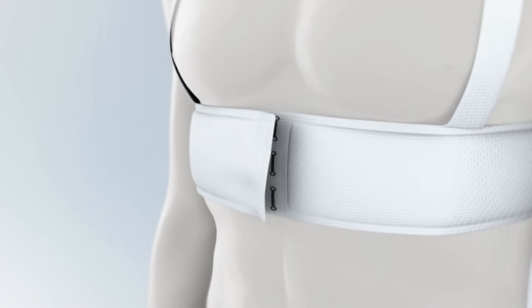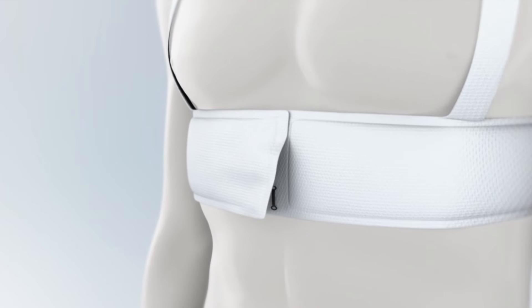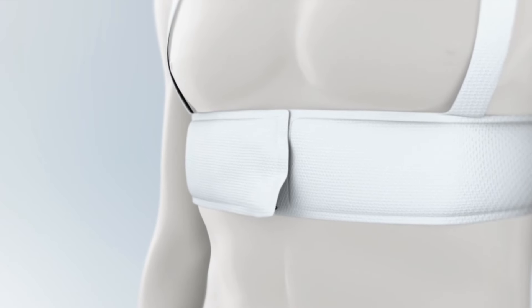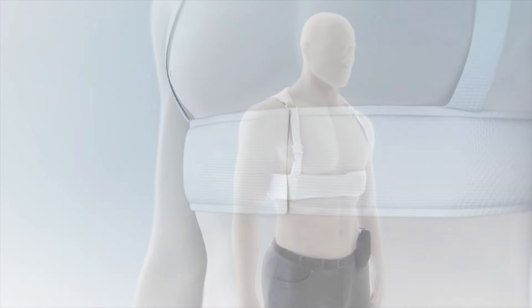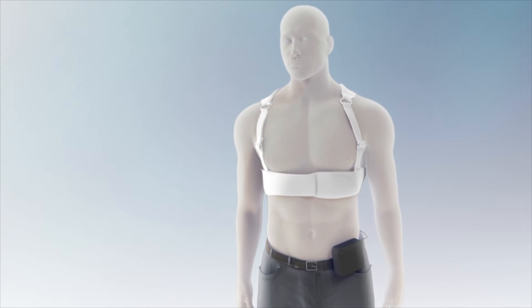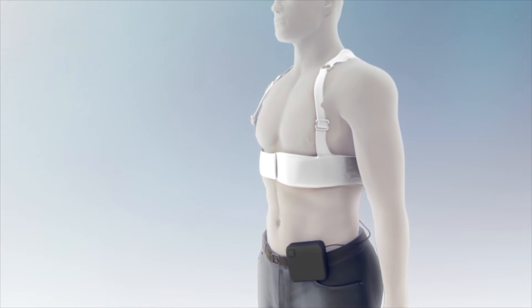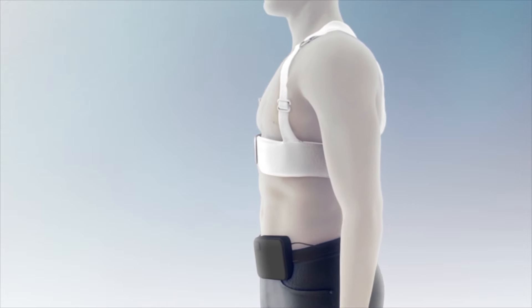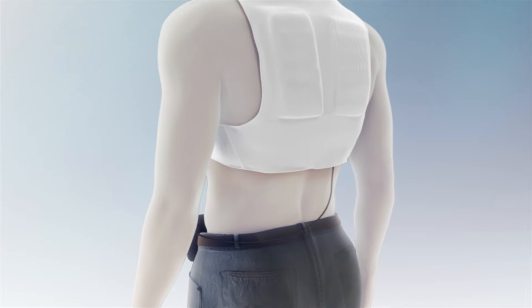Then, slide the Life Vest garment on like a backpack and hook it together at the front of your chest. Make sure that the hooks are fully inserted past the bumps in the clips. When done correctly, you should hear an audible click sound. Women should put on the Life Vest before putting on a bra. Every time you put on your Life Vest, make sure that the garment is not twisted and that the silver side of the therapy pads is facing the silver mesh and is against your skin.